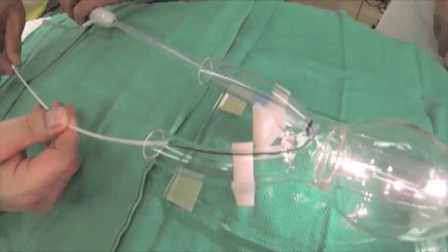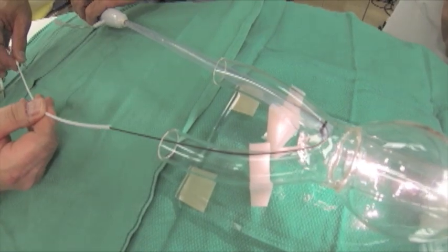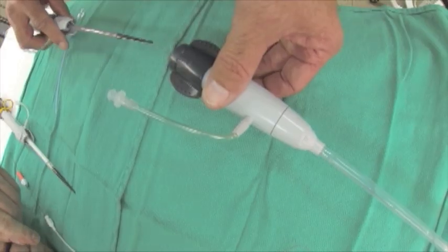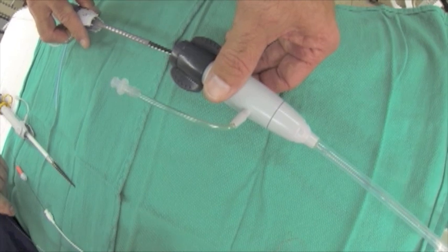Here the wire is snared and then pulled out through the incision while giving slack on the ipsilateral side.